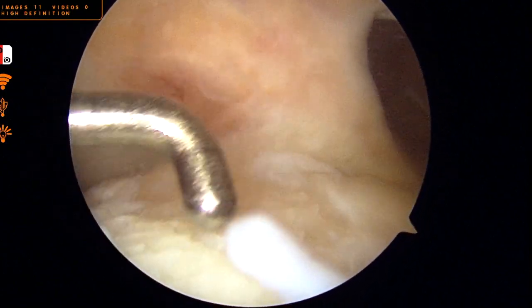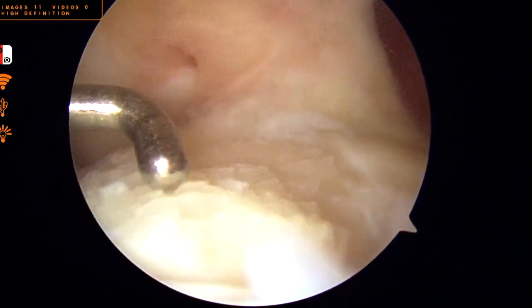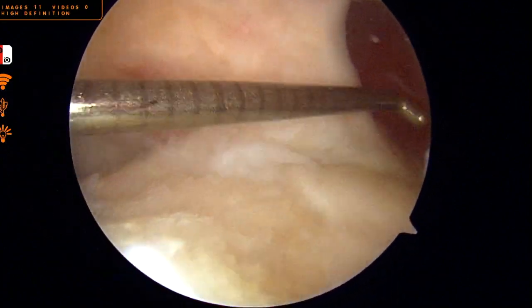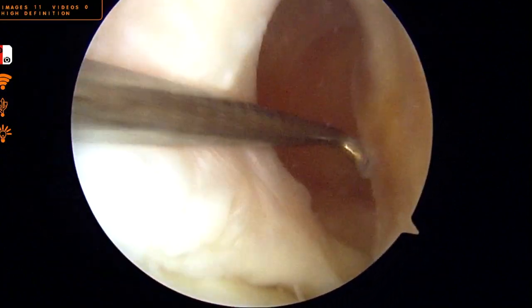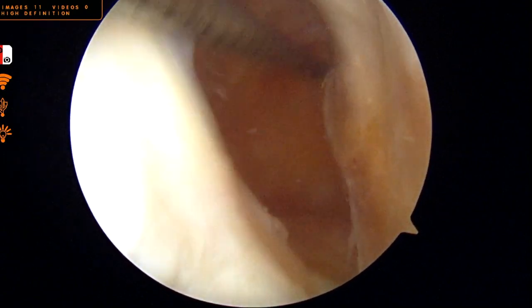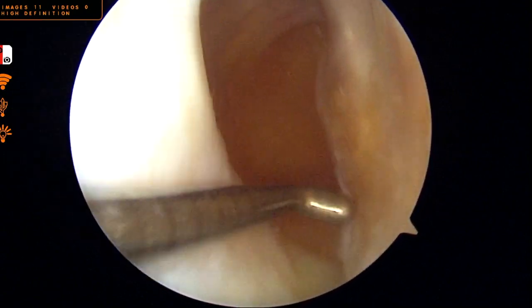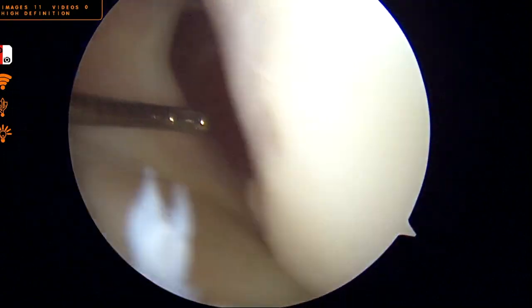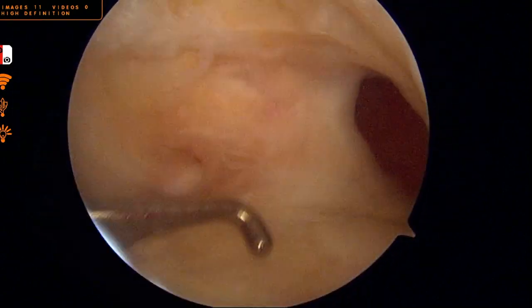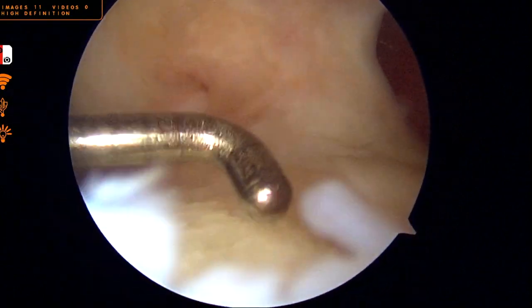With adequate incorporation of bone within both the femur and tibia, we can now proceed with a standard ACL reconstruction utilizing native bone tunnels which can be appropriately placed in the anatomic position.